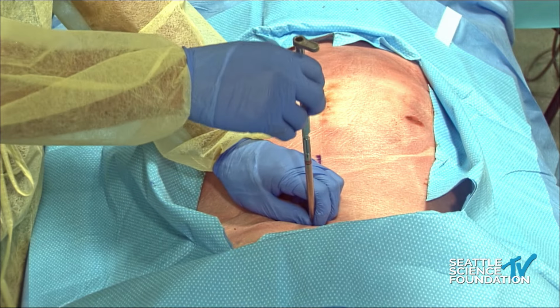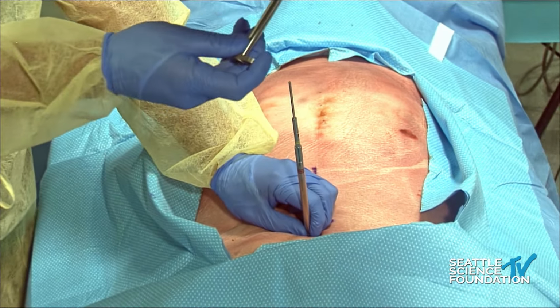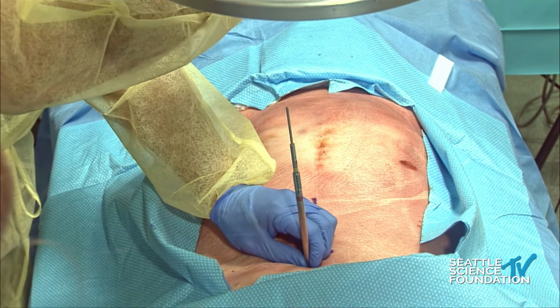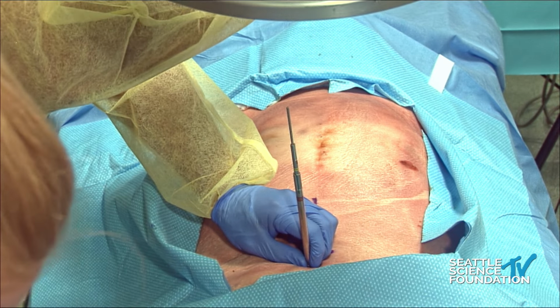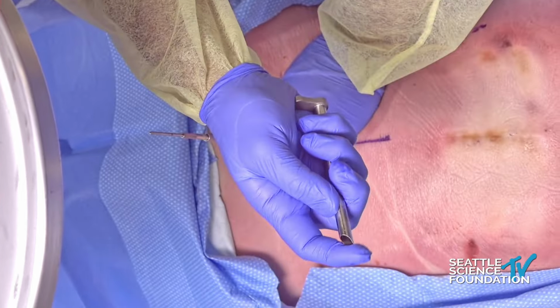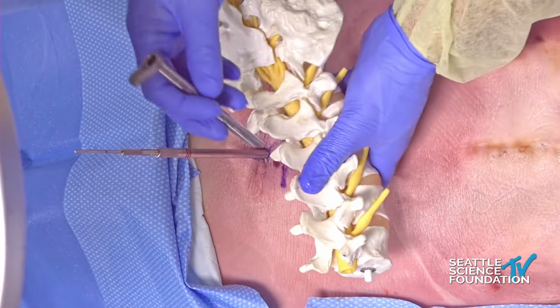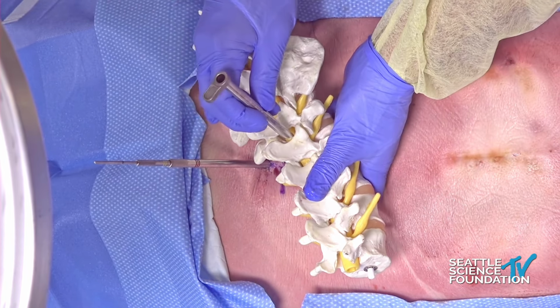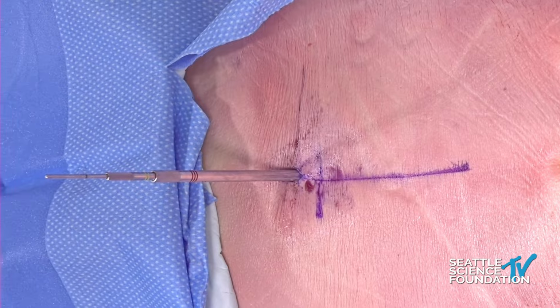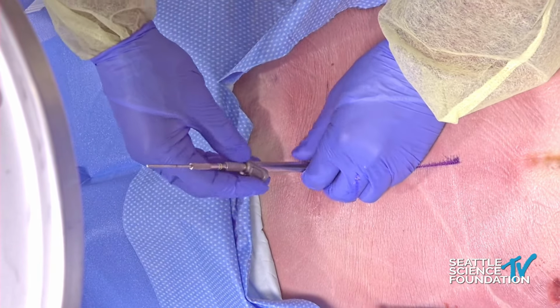Yeah, so just to show you my blunt dissection and what I got, you see when I put the bevel in, I put the bevel in facing me so that this edge of the bevel is sitting on the bone. So I'm not skiving medial into the ligamentum flavum. I'm kind of on the bone, kind of docking like this. If you see here, I'm docking kind of right here. That makes sense, on the edge. So if we get the endoscope in, we can just show where we are, and then that's pretty much the interlaminar approach.